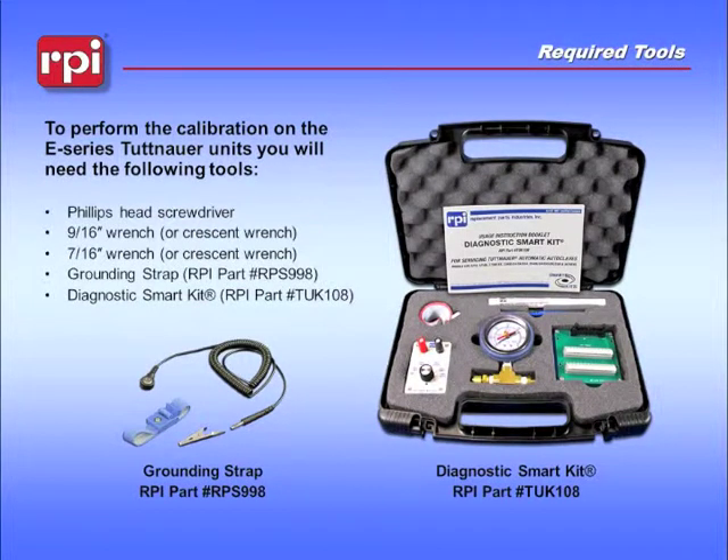To perform the calibration on the E-Series Tuttenauer units, you will need the following tools: Phillips head screwdriver, 9/16th wrench, 7/16th wrench or a crescent wrench, grounding strap, and a Diagnostic Smart Kit.